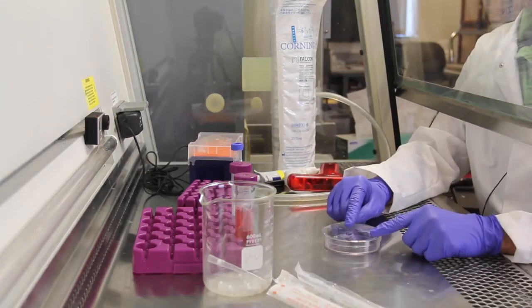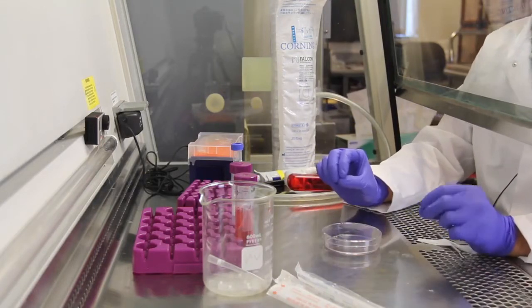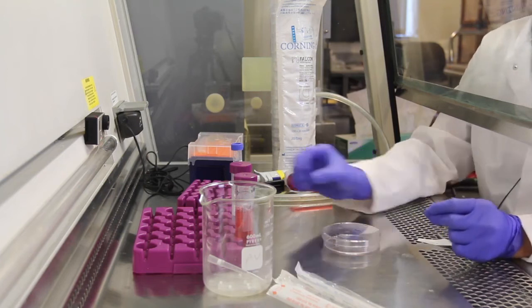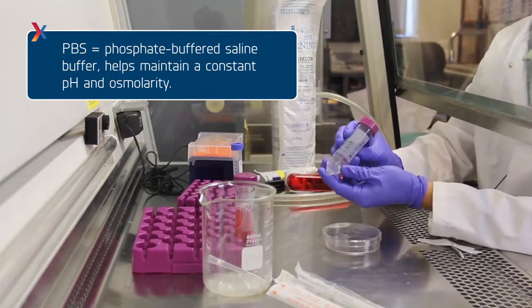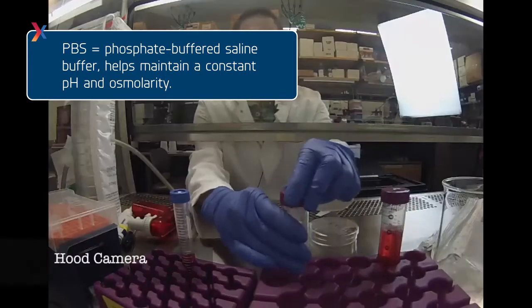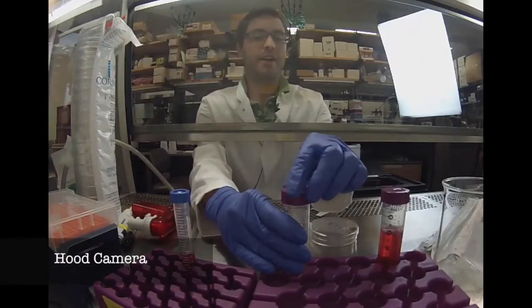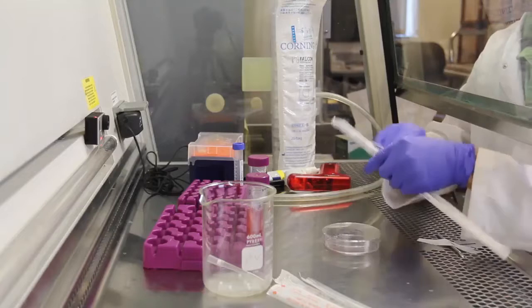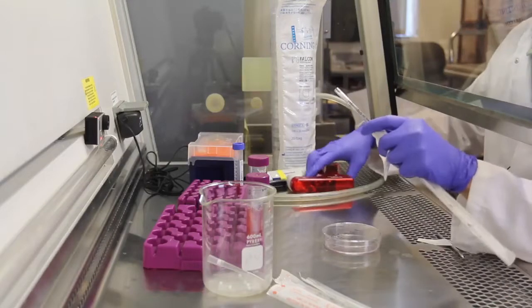Next step is to wash these cells to make sure any remaining dead cells are gone and any other sort of contaminants are gone. I do this using 1x PBS. Before using any tubes, I like to pre-loosen the lid because when I'm working on it with one hand, it'll make my life a lot easier.